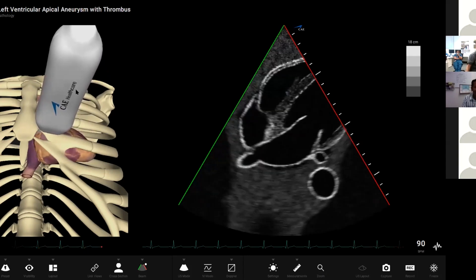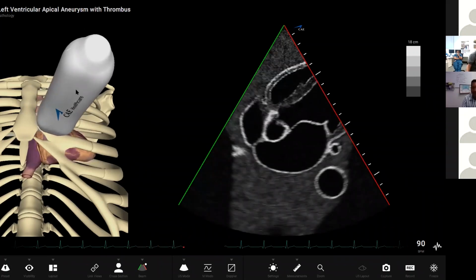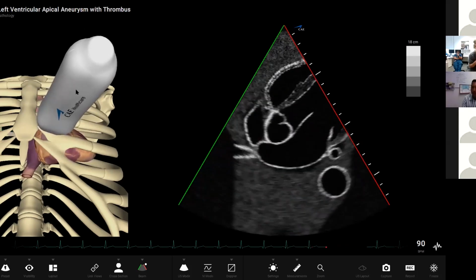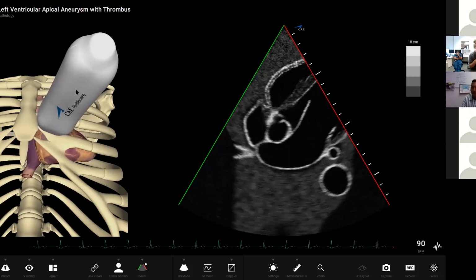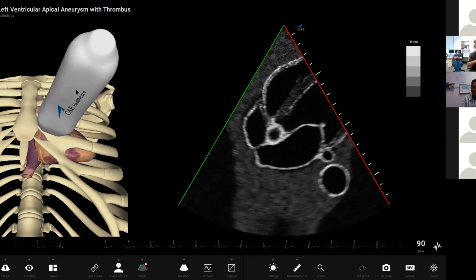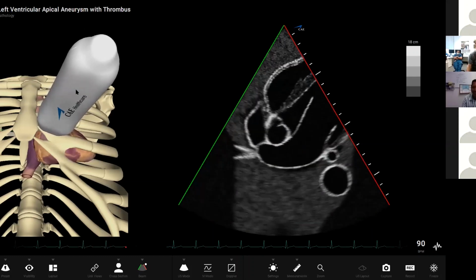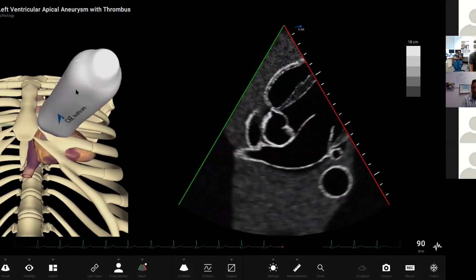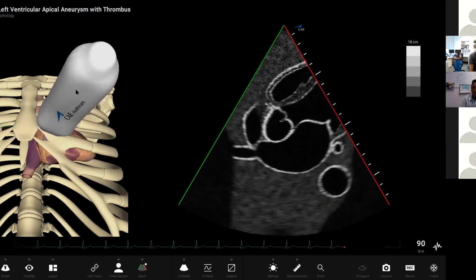So I think taking time, being patient, getting yourself seated down. I do a lot of echoes on my knees because I'm lazy and I'm doing a quick focused study, and that's probably bad practice. If you're doing full studies, taking your time should be what it's about, but sometimes you have to do quicker studies. Just try to avoid bad habits.